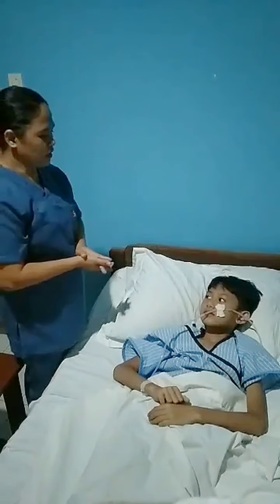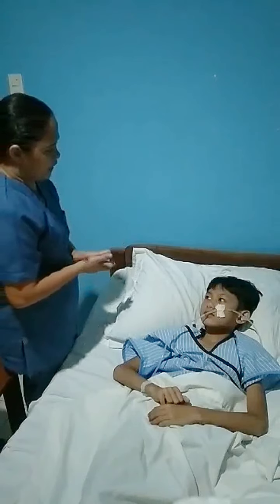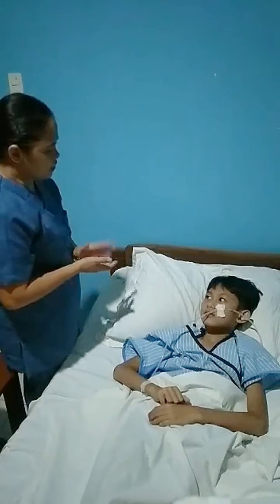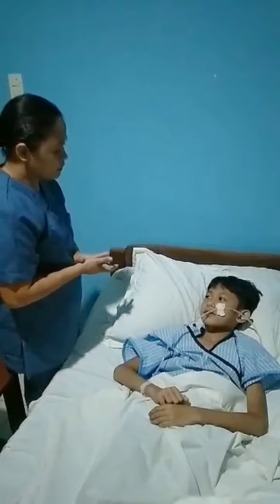Sir Ryan, your doctor has instructed to give you this formula for your feeding. And if you feel like vomiting, please let me know as soon as possible. That way, we can stop the feeding immediately, okay?